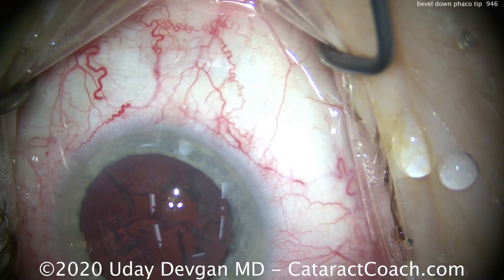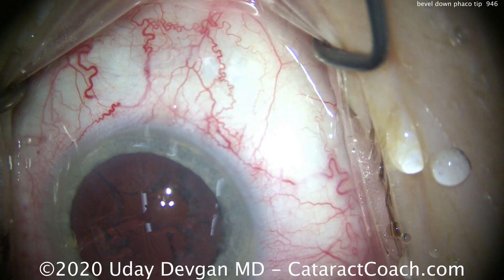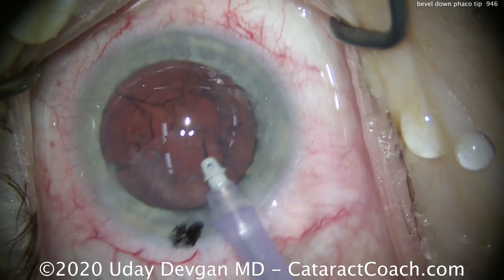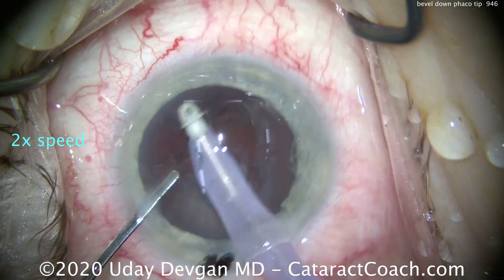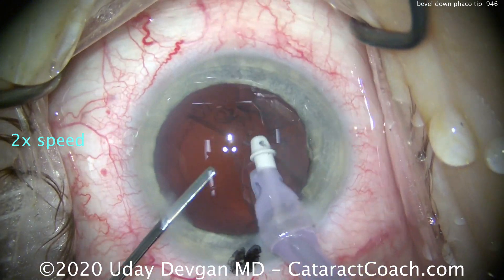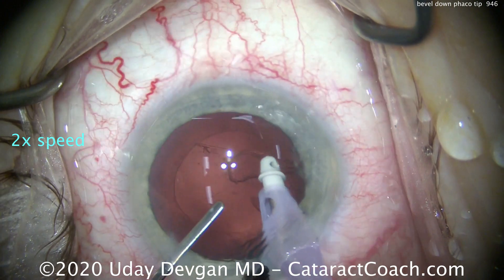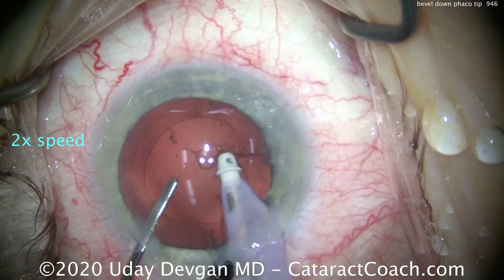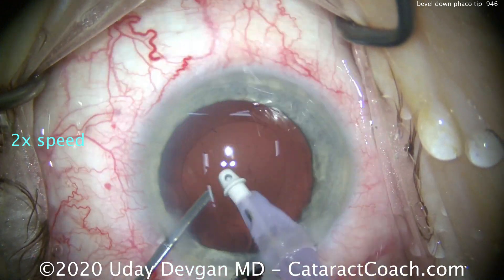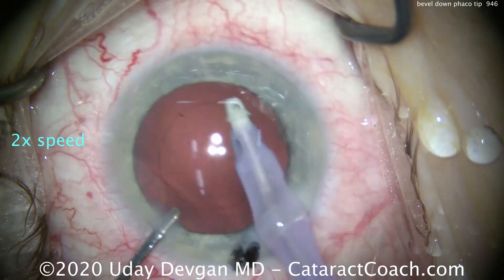Now what if you're using a Venturi machine? On a Venturi machine, you can achieve high vacuum immediately whether or not you have the tip occluded. So maybe you'll have better holding power with an unoccluded tip, and therefore bevel up would be fine or equally as good. But since most of us are using a peristaltic pump to do phaco surgery, we want to use the method that's going to give you the best occlusion and therefore the high vacuum level to hold the nucleus to chop it.